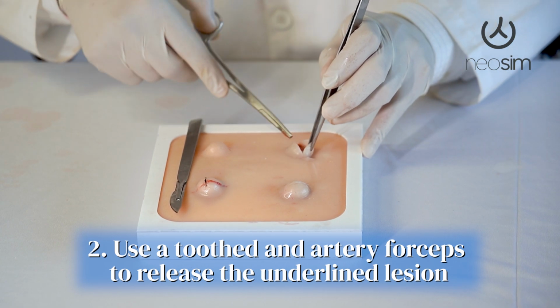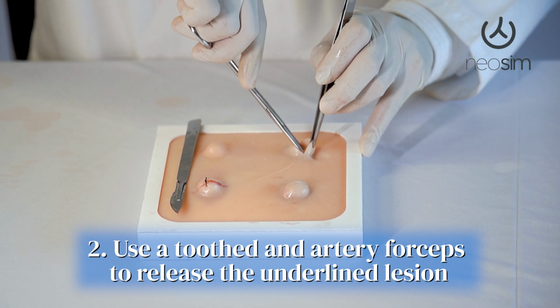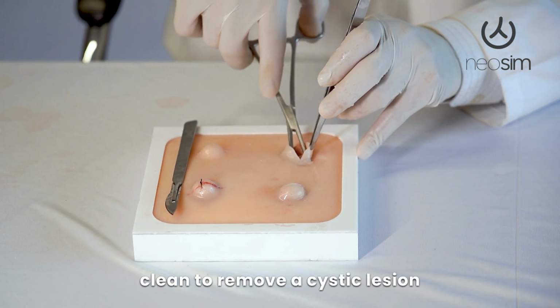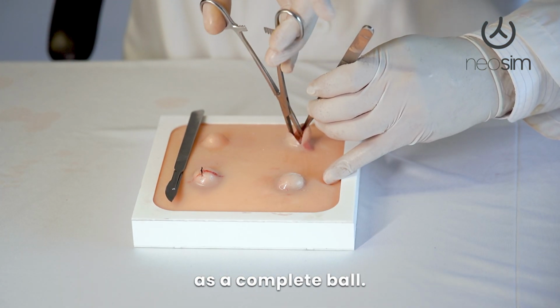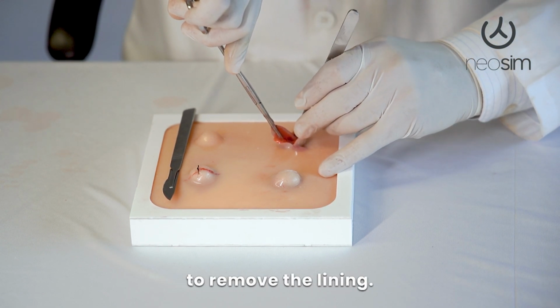Use tooth forceps or a plain forceps to hold the upper tissue, and then we use an artery forceps to release the underlying lesion, because it is always neat and clean to remove a cystic lesion as a complete ball. Otherwise, it becomes too messy and very difficult to remove the lining.